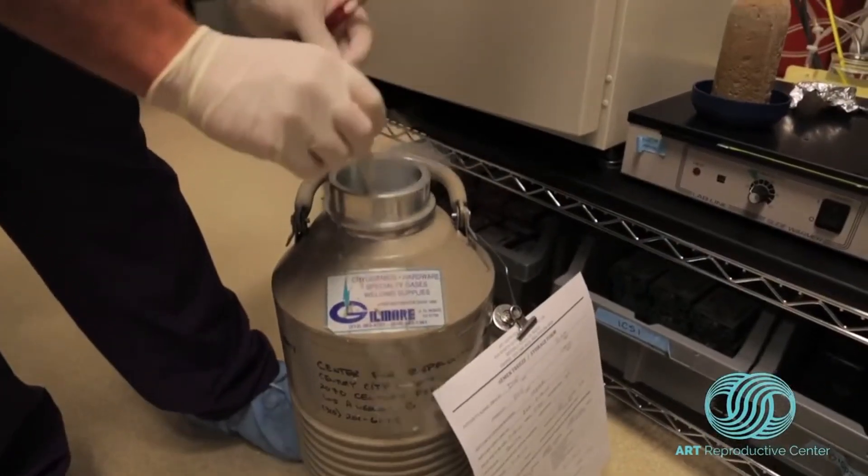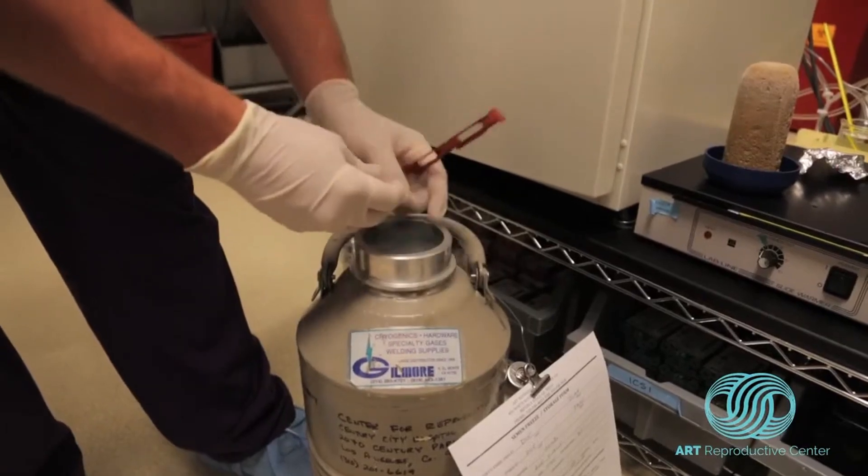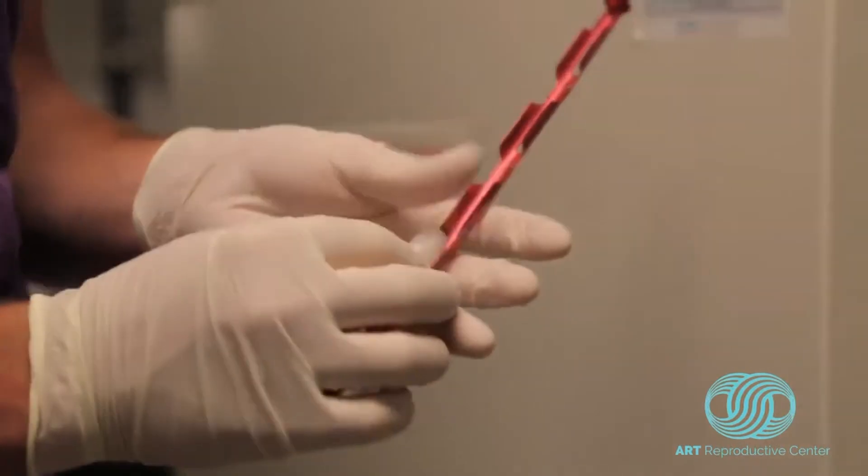This video shows you the process of a sperm vial being thawed. You can see the embryologist removing the vial from the cryotank where it has been stored in liquid nitrogen.